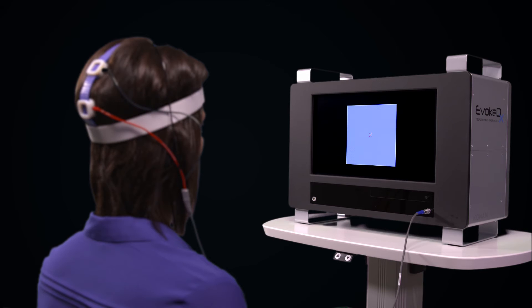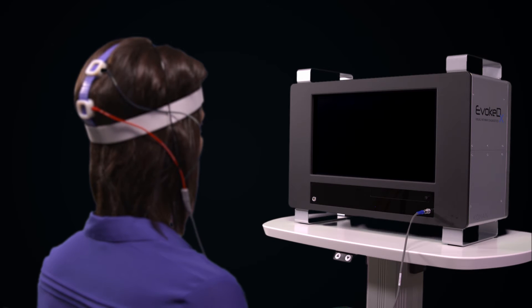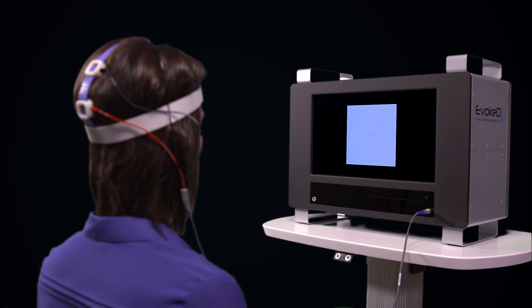The visual stimulus is driven by a high specification organic LED display presenting precisely calibrated stimulus patterns.